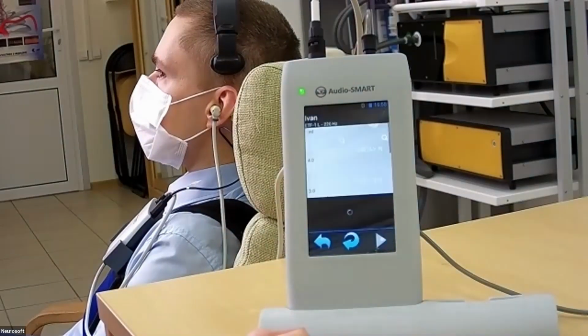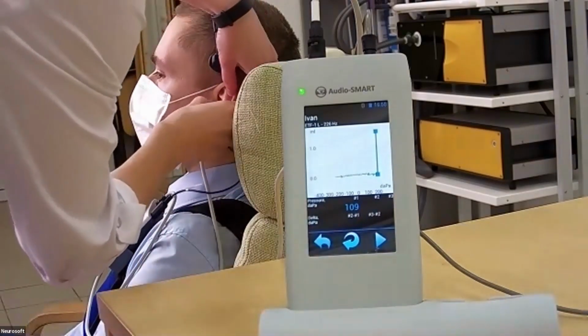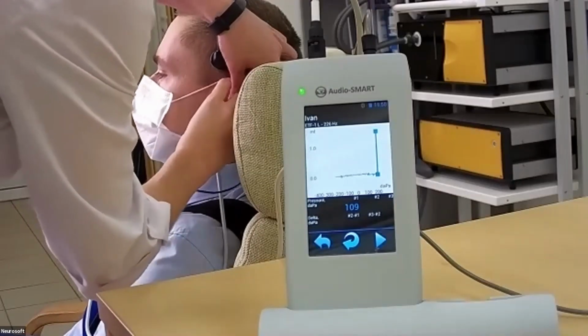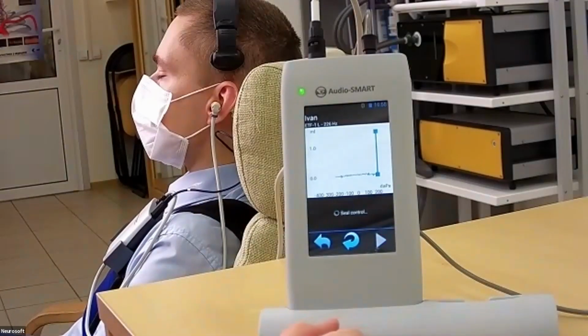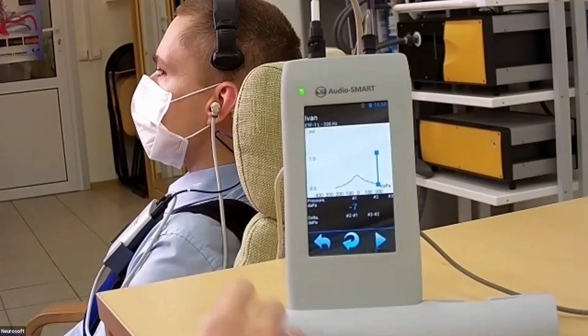The first step is the registration of tympanometry. Okay, the probe is go out, I think. Okay. In some cases, it is useful to put the probe one more time.